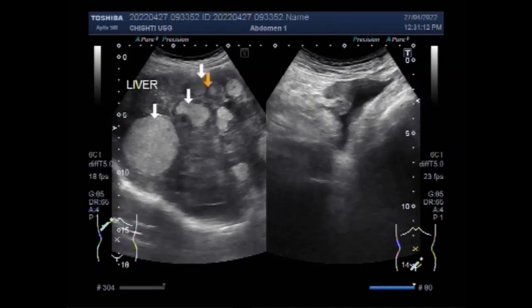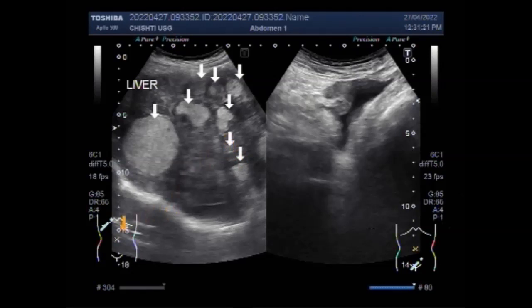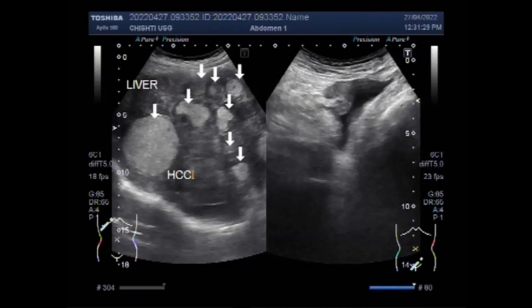Coarse hepatic echotexture is a sonographic description used when the uniform, smooth hepatic echotexture of the liver is lost. This can occur due to a number of reasons, including conditions that cause hepatic fibrosis.